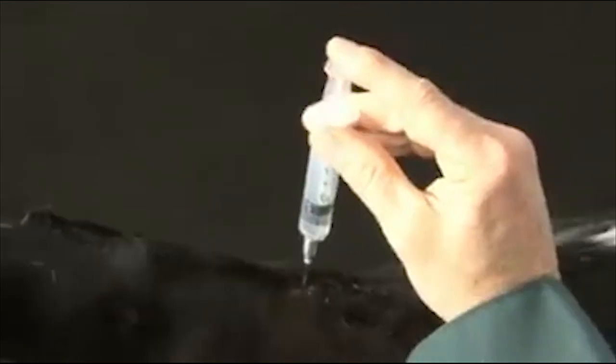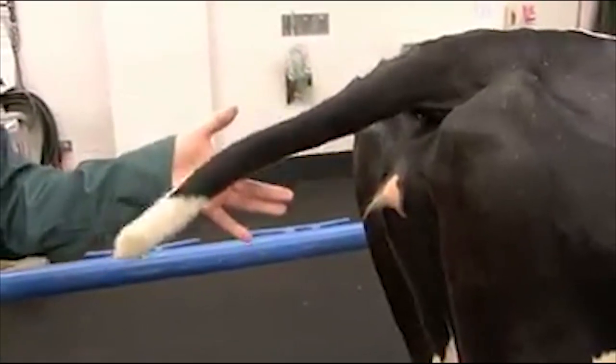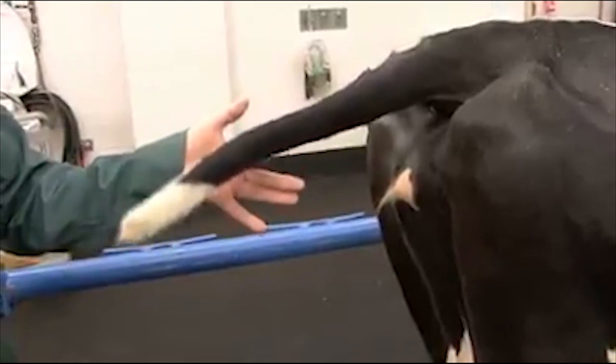When you are finished with the injection, remove the needle and syringe and allow approximately 3 minutes for the anesthesia to take effect. You can check the efficacy of your block by evaluating the tail tone of the patient. The tail should be flaccid and easily lifted.